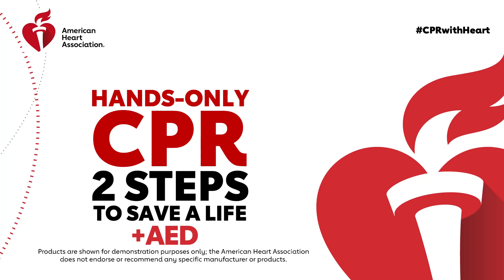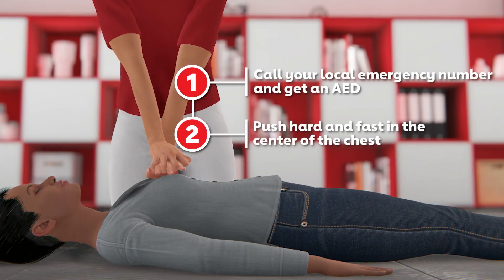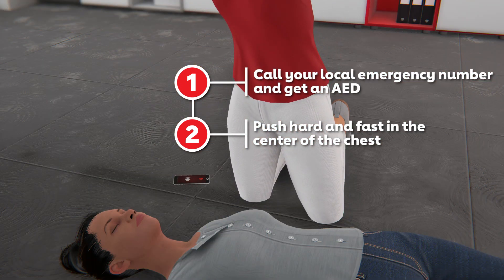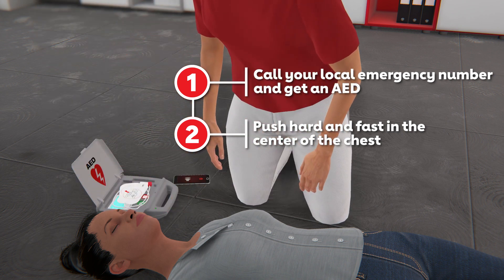If you see a teen or adult suddenly collapse, it is important to act fast. Helping to save a life is easier than you might think. You have been performing hands-only CPR on an adult when the AED arrives. You have the victim face up on a firm, flat surface and are ready to continue hands-only CPR with an AED.